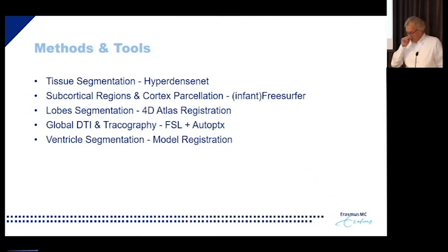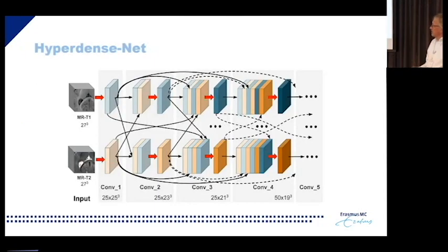And then you have to think about tissue segmentation. So the intracranial volume, the amount of gray matter, white matter, CSF. But we can go further. You can also divide the brain into smaller regions. I will come to that later. Detection of the lobes, DTI is of course an interesting possibility. And we are currently working also to detect or segment and label the ventricles, the big ventricles.